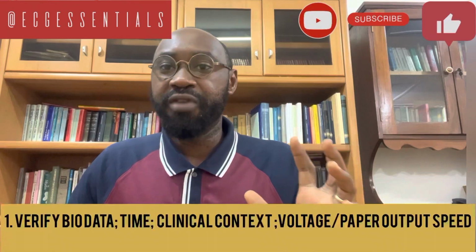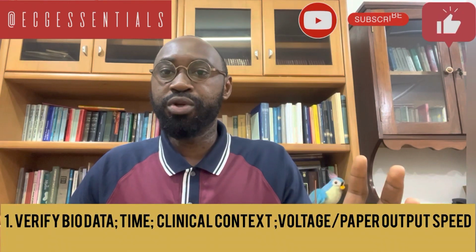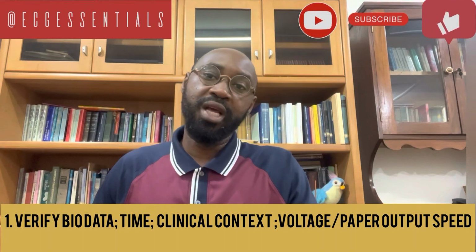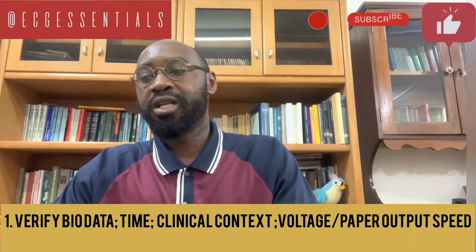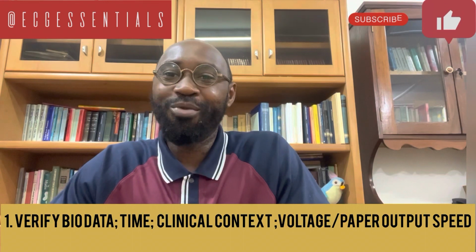So let's quickly start with these steps that I am talking about. We start with verifying the biodata of the ECG that we are going to read, or the individual whose ECG we are going to read. And that comes with the name. It comes with verifying the age, verifying the sex of the individual. We also have to pay attention to the dates that the ECG was recorded.